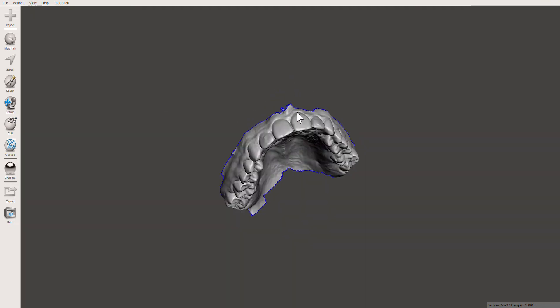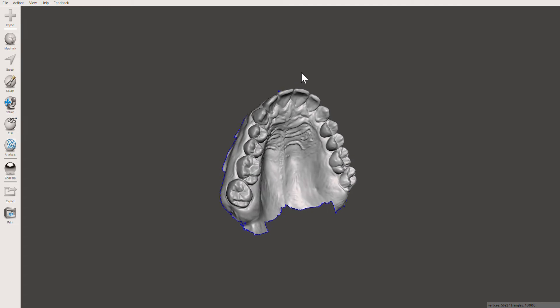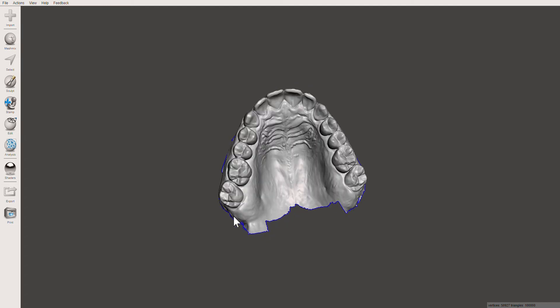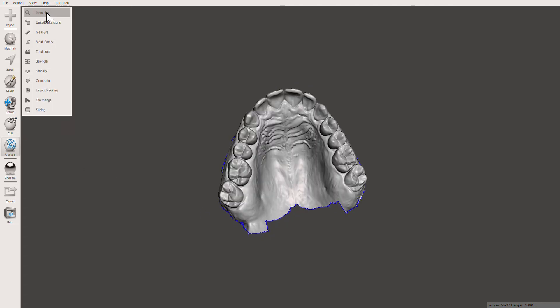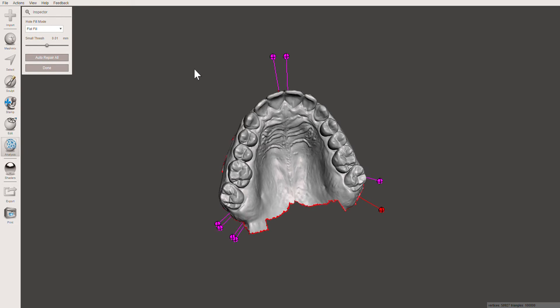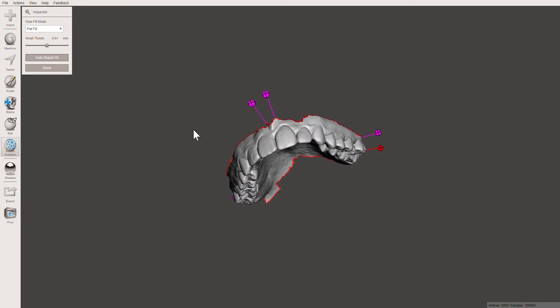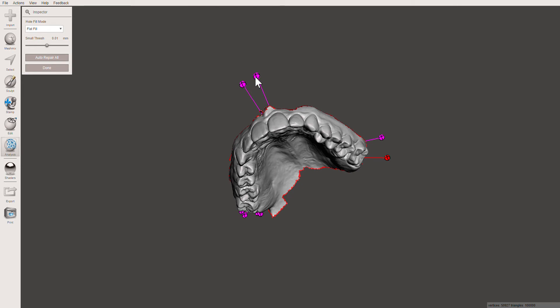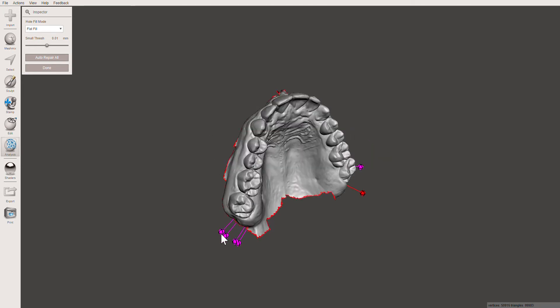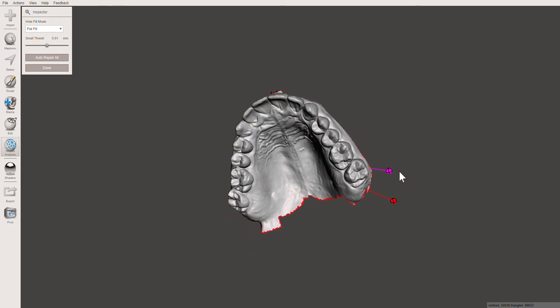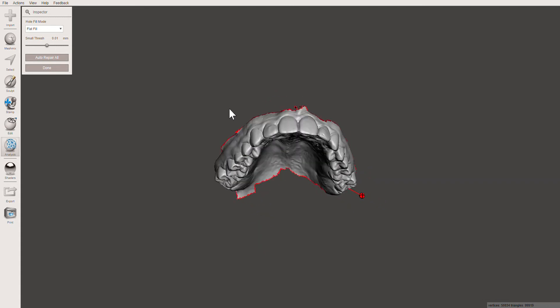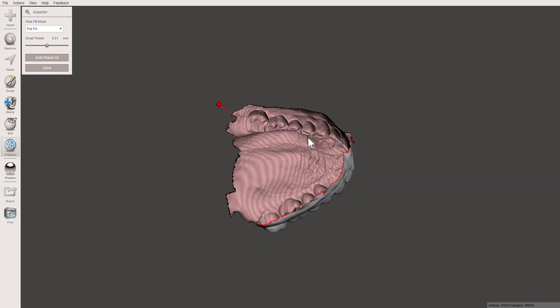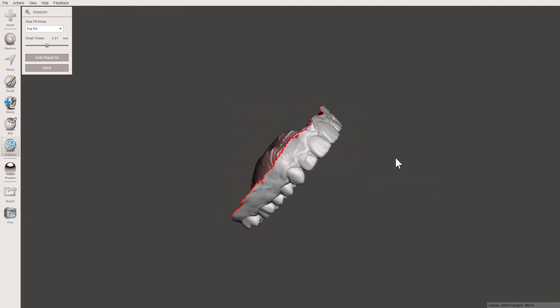Now I'm going to go into Analysis and press Inspector. This is going to show us some holes that were in the model from the scan. I'm going to click on the pink bubbles — there's a pink one and there are red ones. I'm only pressing on the pink and not the red, because the red indicates the boundary of the model and clicking it would fill in the entire model, which I don't want.